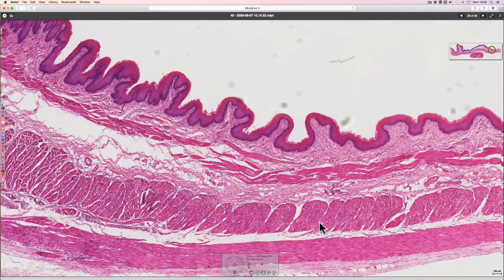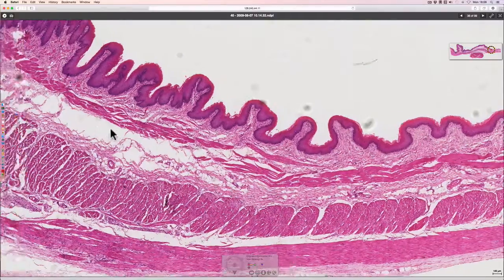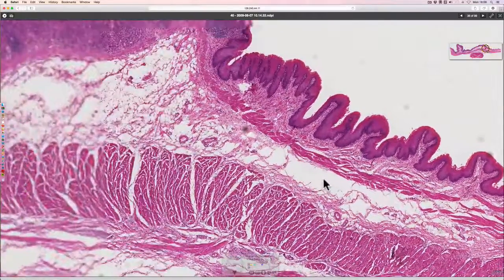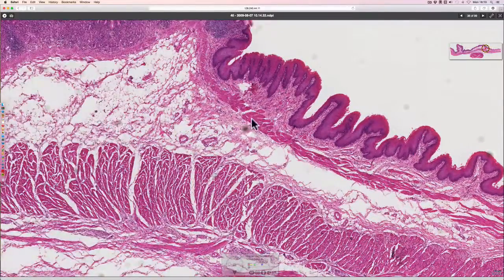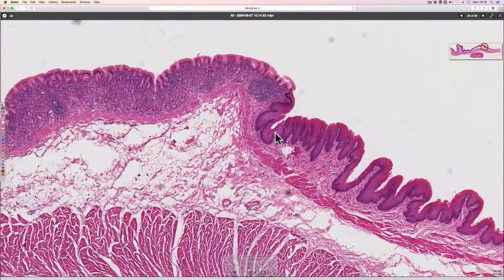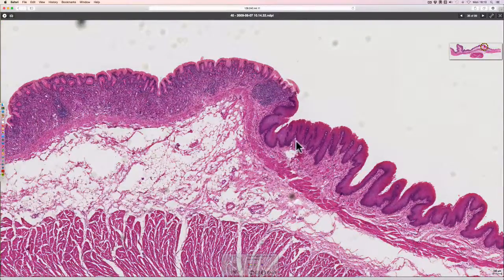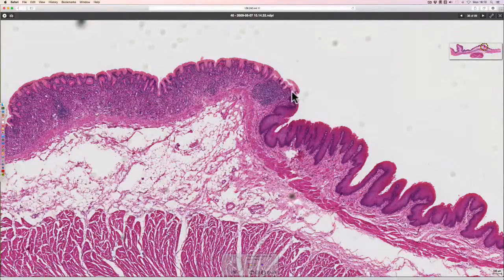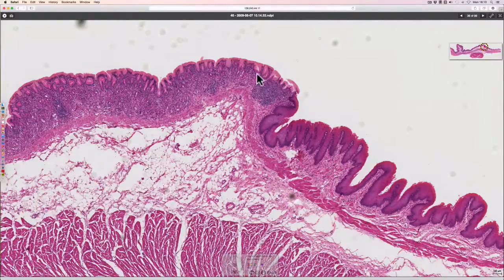Moving along to the junction, we can see an abrupt change in epithelium from the stratified squamous type sitting on the basement membrane to a different type. In this case the epithelium extends all the way from the surface right down through the full depth of the mucosa.